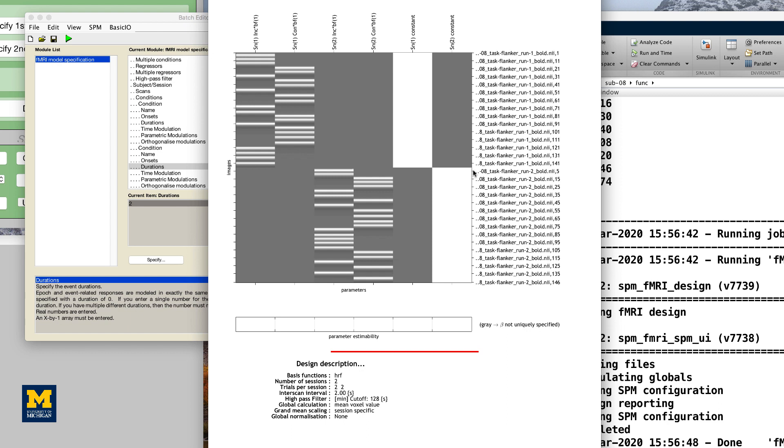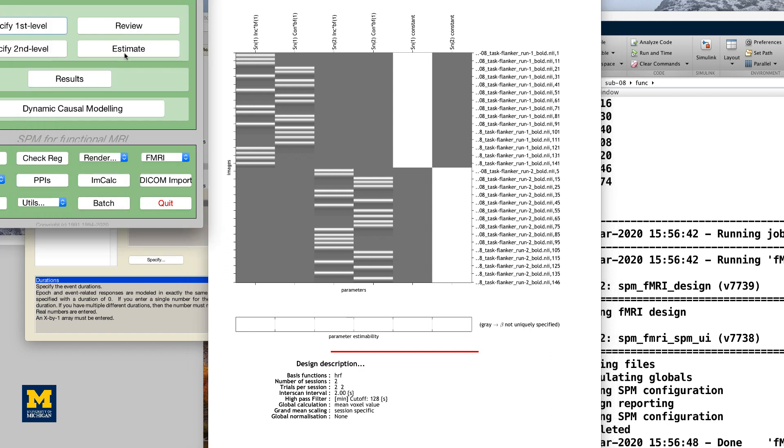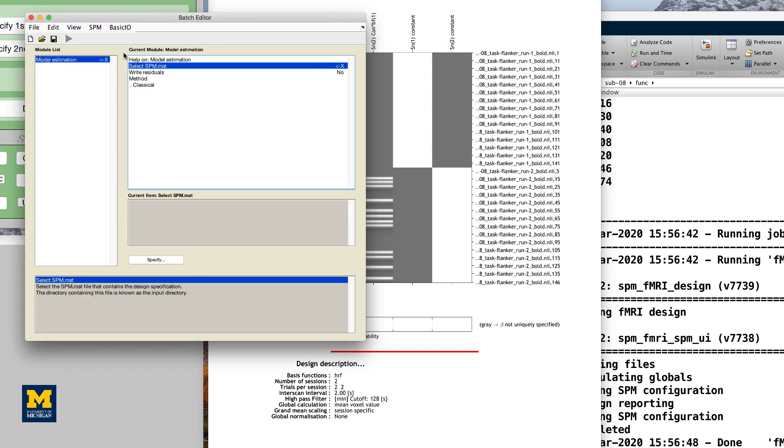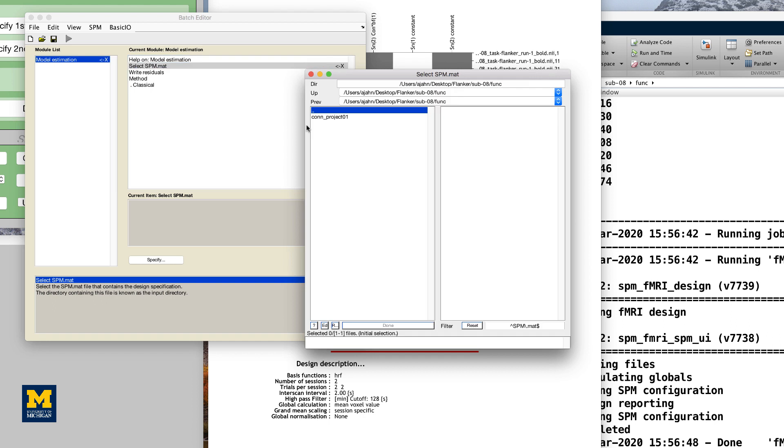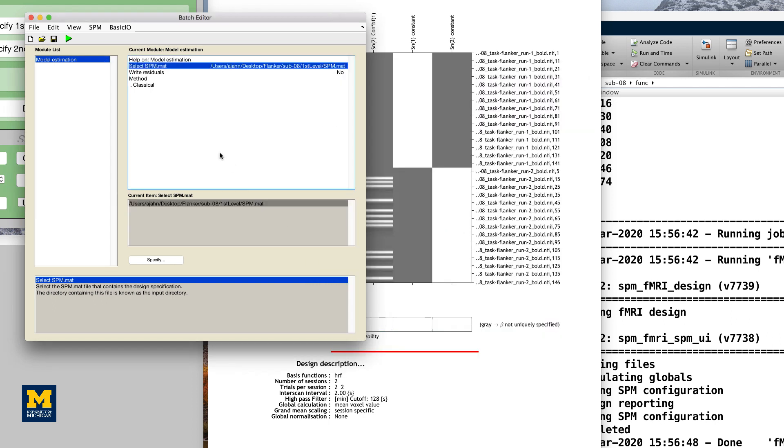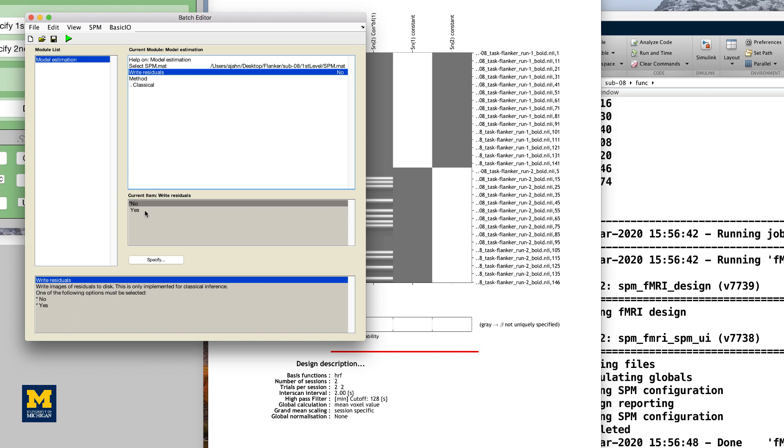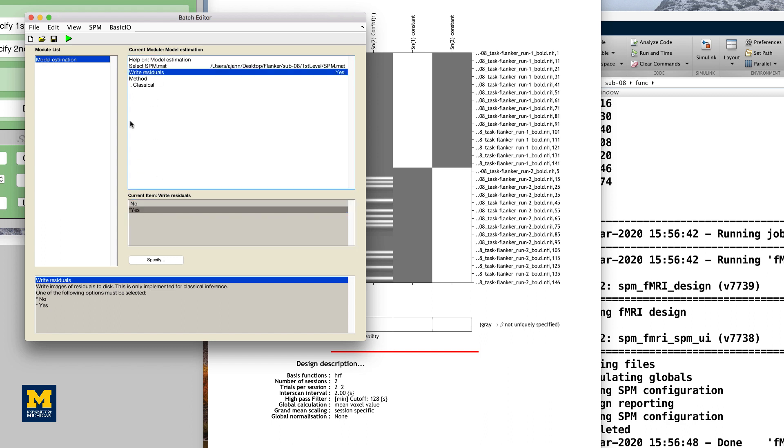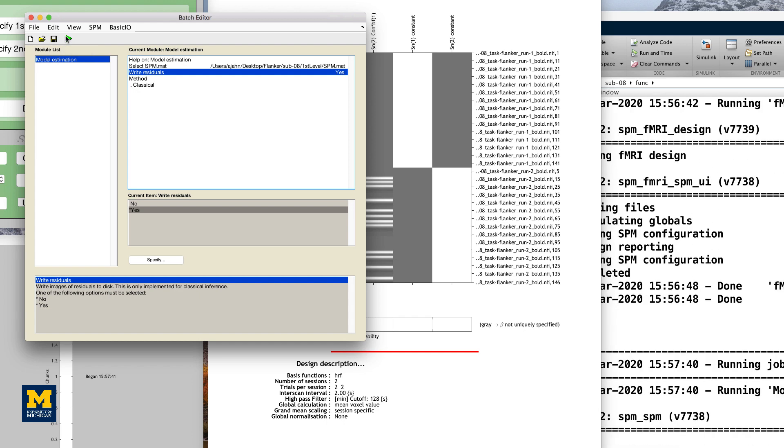Now that we have created our GLM, or general linear model, we will need to estimate the beta weights for each condition. From the SPM GUI, click Estimate and then double-click on the field Select SPM.mat. Navigate to the first level directory and select the SPM.mat file you just created, and then change the Write Residuals option to Yes. Then click the green Go button. This will take a few minutes to run.